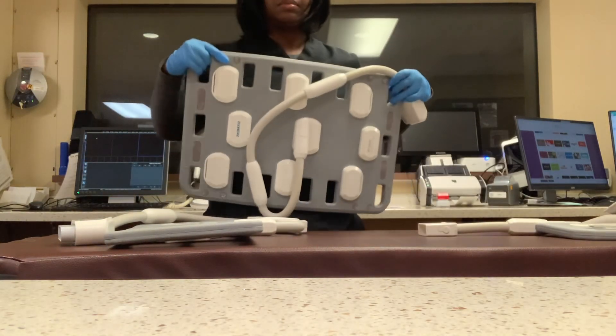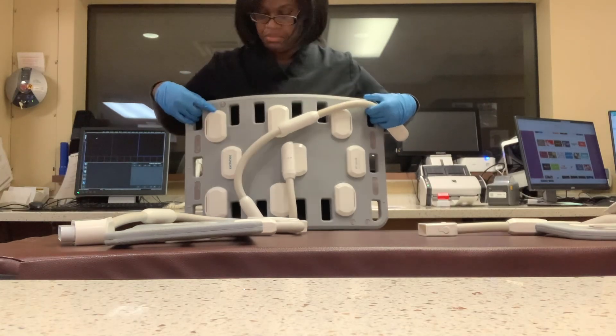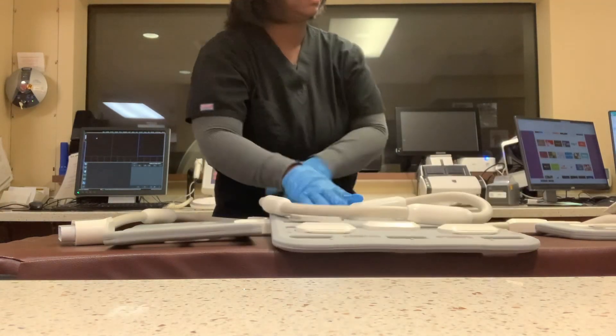Now we have the body coil. It can be used for your chest, abdomen, forearm, humerus, femur, or tibia/fibula.